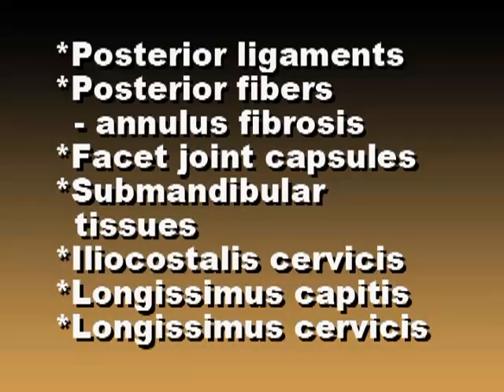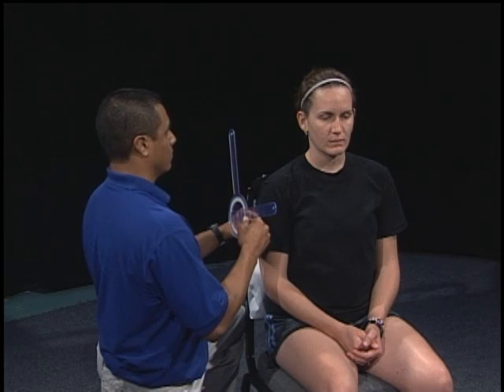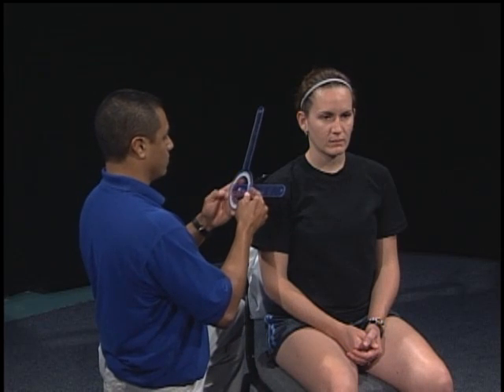Also because of impaction of the submandibular tissues against the throat and passive tension of the iliocostalis cervicis, longissimus capitis, longissimus cervicis, and various other muscles. Refer to your text for a complete list. Now you're ready to measure the joint range of motion.